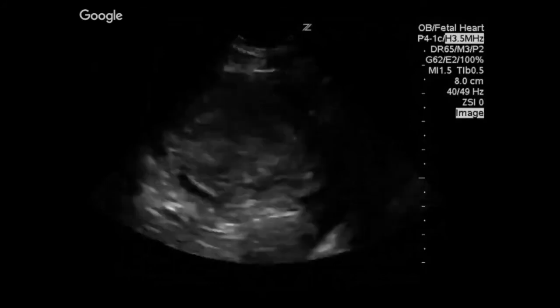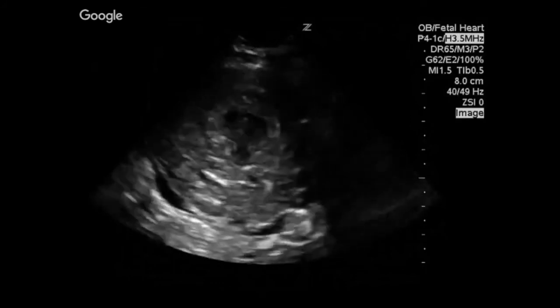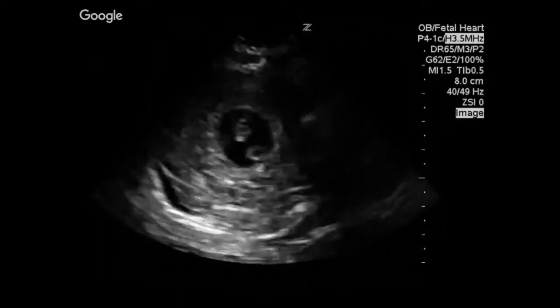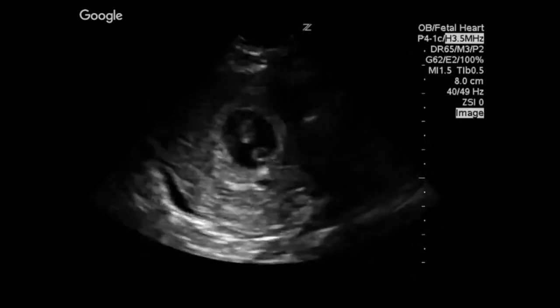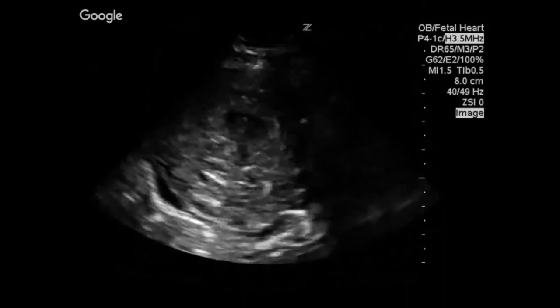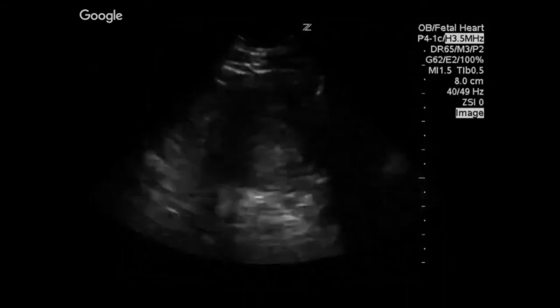That looks like a baby. So other cystic formations that you can get in the abdomen. You can see the heart. Mazel tov. You can see the little heart beating. I'm sure this patient was very happy. Probably it's a nurse. Sometimes it can be a nurse that wants us to scan her, but usually it's a patient, I don't know. Usually if it's a nurse, it's a colleague. So probably it's a real patient. Yeah, I've seen a few.